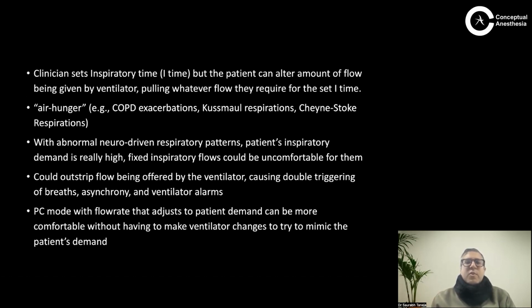But in pressure control, when they can have an increased flow, they can adjust better to this and there will be fewer causes of asynchrony, ventilator alarms and double triggering of breaths. So in those patients with high flow demands, you can actually try this mode of pressure control. Sometimes it is better for the patient, better for synchronizing the breaths, especially in patients with air hunger.